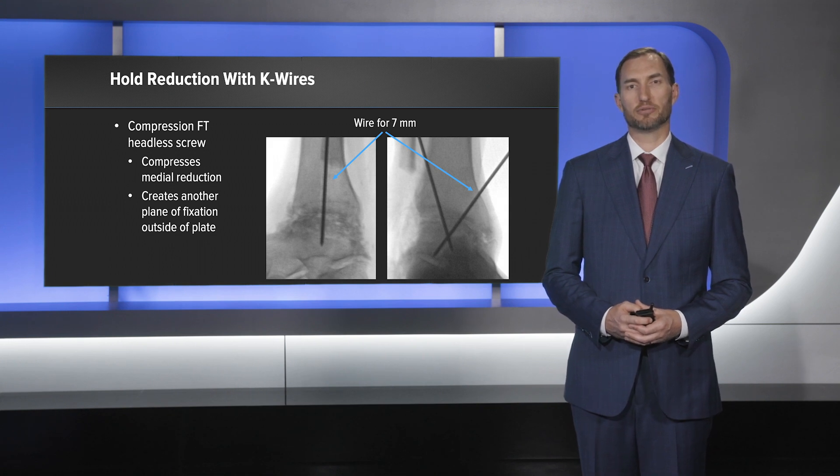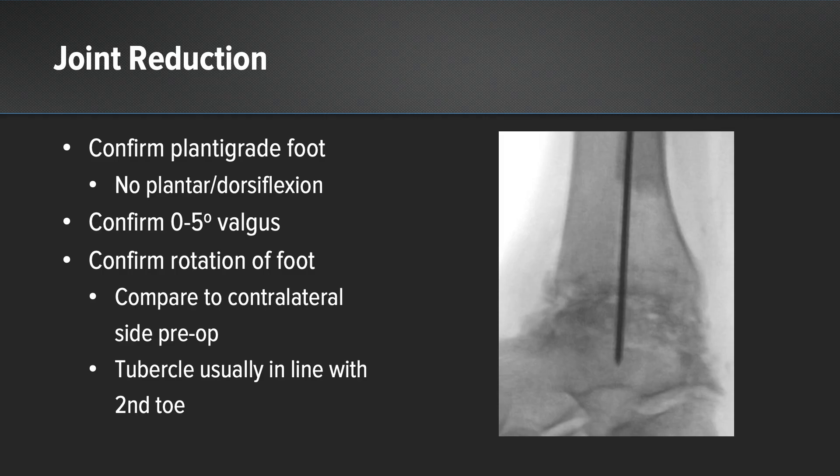A second K-wire is then placed from the anterolateral tibia. Then I confirmed my reduction with fluoroscopy. I confirmed that I had a plantigrade foot and there was no excessive plantar or dorsiflexion. I evaluated the hindfoot to make sure I had 0 to 5 degrees of valgus.